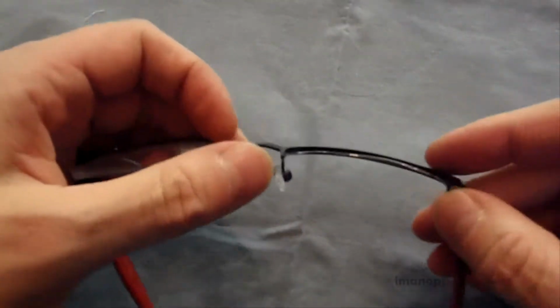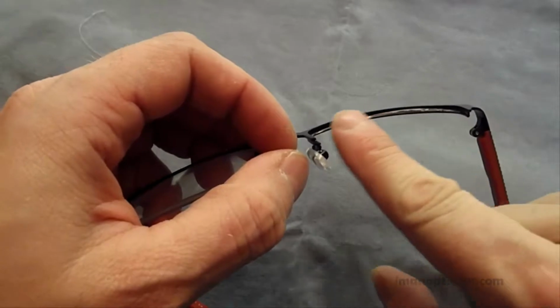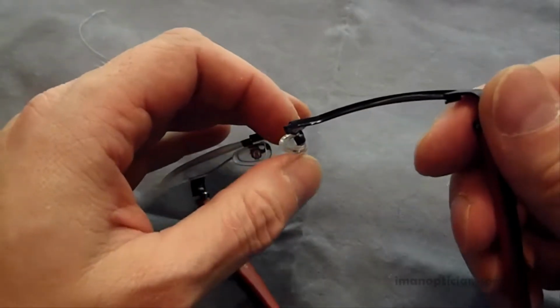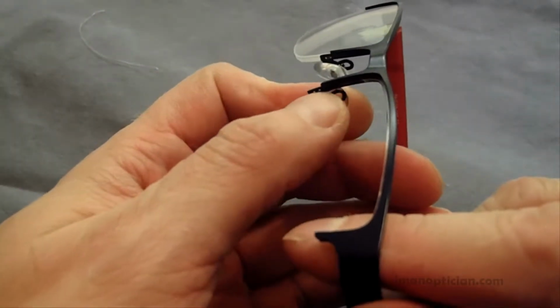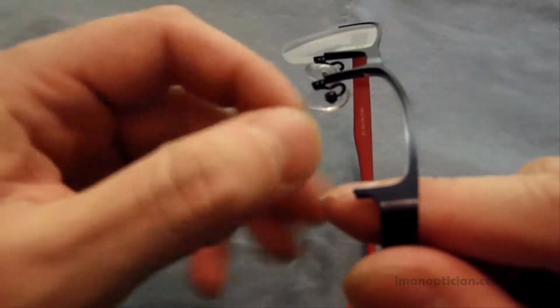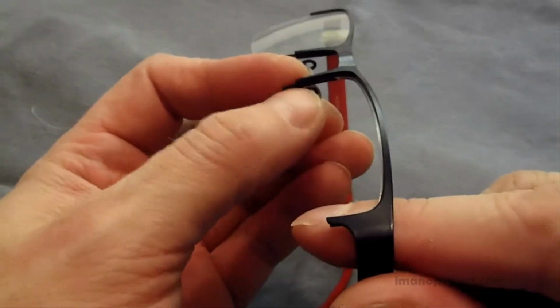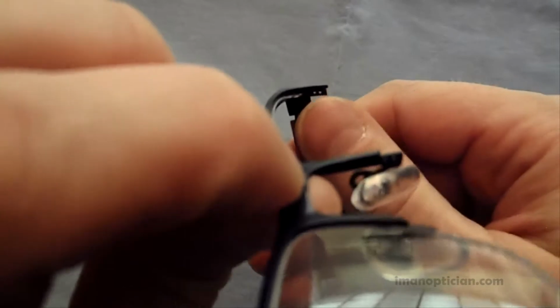Now you want to make sure when we have this out that we double check our figure 8 liner that's through here, and make sure that's in good shape. If we have to replace that, now's a good time. Also make sure that our groove is all cleared out. Again, sometimes this wire fractures and splits, and you get little pieces built up in there. So we want to make sure that's all cleared out, and that these two holes on both the nasal side and the temple side are quite clear, and there's no debris in there. Otherwise, again, get in there with your pin and just punch them out, to make sure all the little debris is out of there.